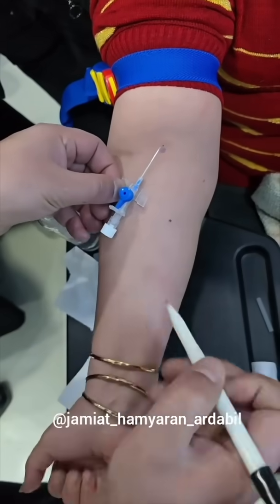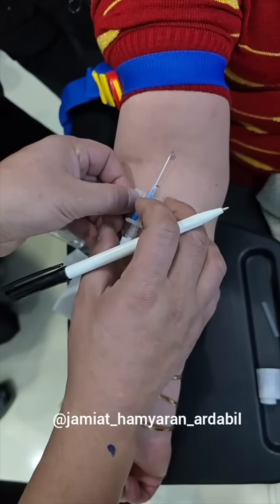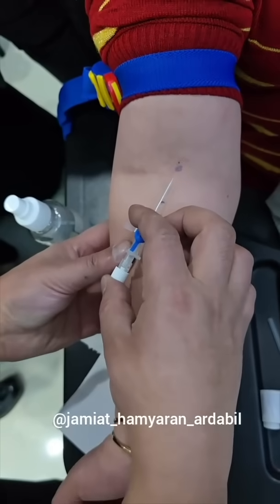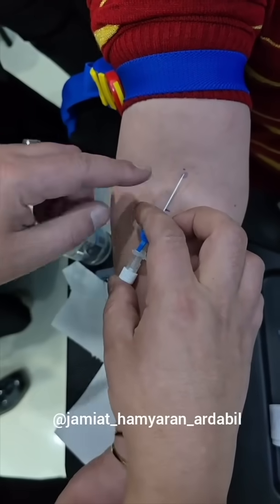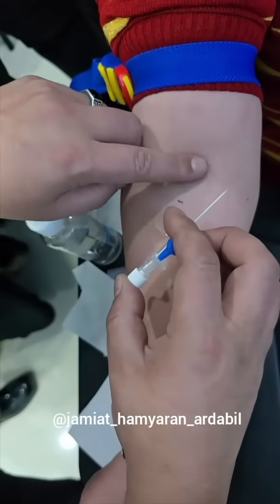This video is in another language, but I think he's demonstrating that the vein is up high and the insertion point should be lower. Usually only the tip of the catheter would be in the vein, making it more likely to dislodge and infiltrate. You want as much catheter as you can get in there.